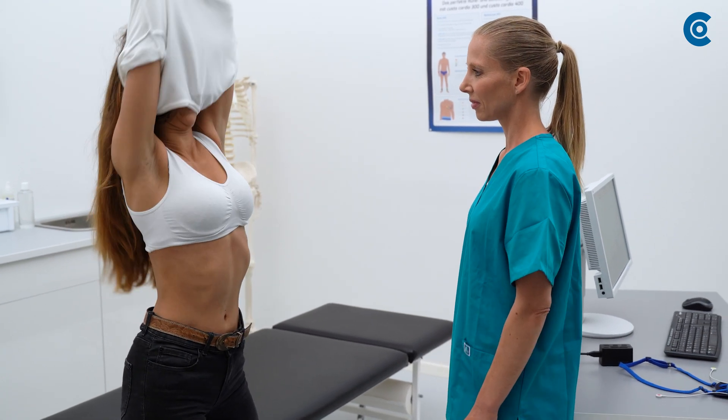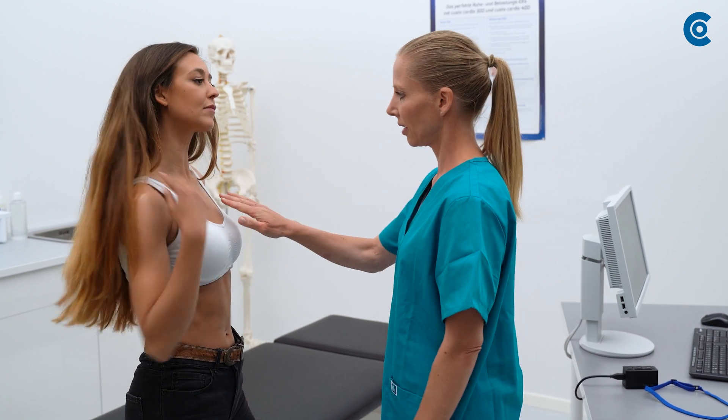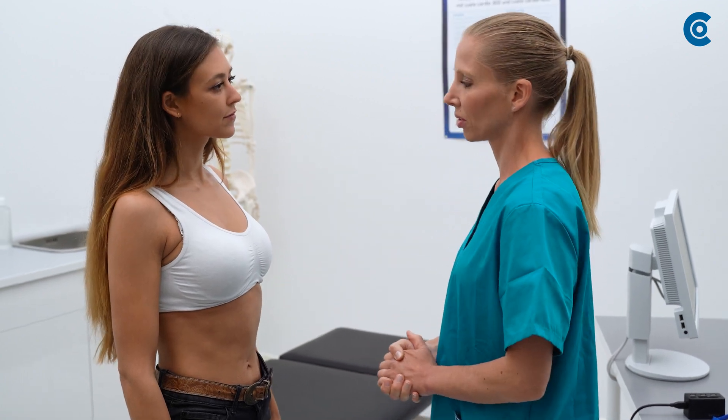Prepare the patient for the measurement during the initialization. Make sure the skin where you will attach the electrodes is free of hair and other debris. You may need to shave the patient and clean the skin.